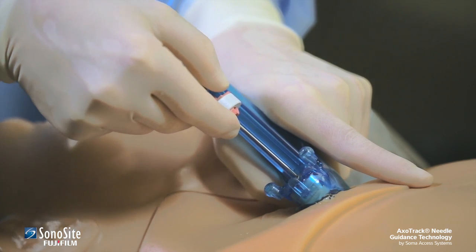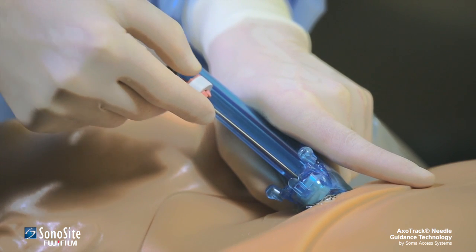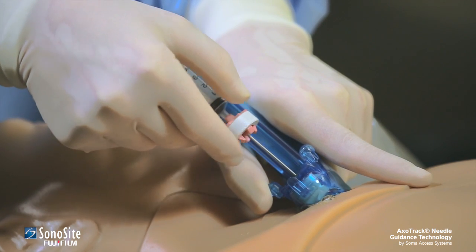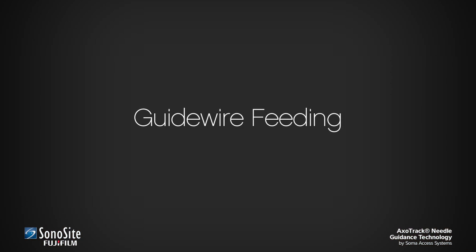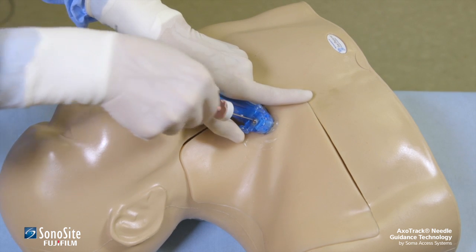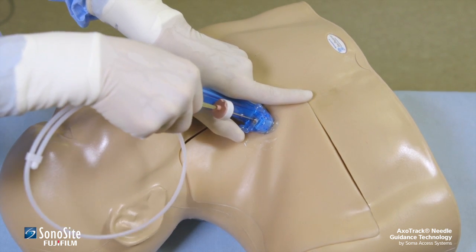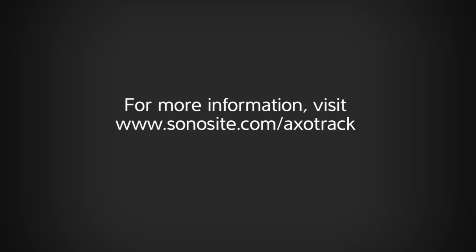Orienting the transducer perpendicular to the body surface may result in a sharp bend of the guide wire at the needle exit point, which could make it difficult to feed the guide wire. To facilitate guide wire passage, it is desirable to impinge the target vessel at an angle 30 to 45 degrees off perpendicular. This requires tipping or leaning the transducer on the body surface to provide the desired angle of approach to the target vessel. Placing the transducer at the desired angle is easily done when approaching either the internal jugular or subclavian vein. For more information, please visit sonosite.com/axotrack.